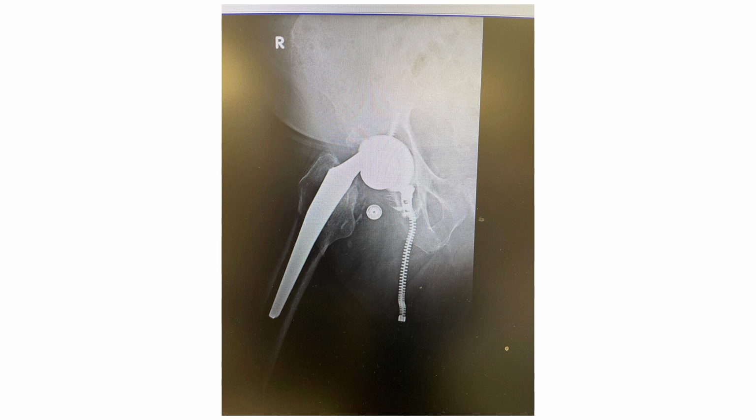The next example is of a patient that had this implant put in about 8 years ago, with the cup at a different angle. So every time the patient rotated their leg, the femoral component banged against the acetabular cup component and actually broke the femoral component's metal in half. And recently, as early as last week, I had to go in, take out the old one, and reorient the cup so that the patient wouldn't be doing that. And the redo operations are very long, the recovery is a lot longer, and there are a lot more complications that can happen.